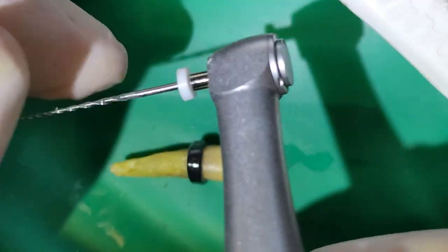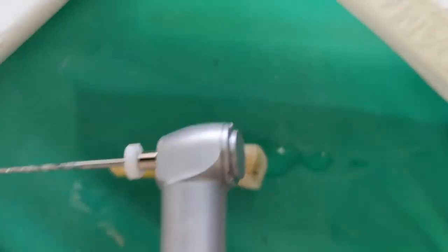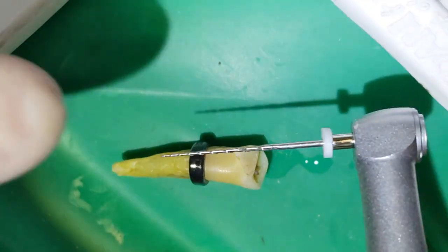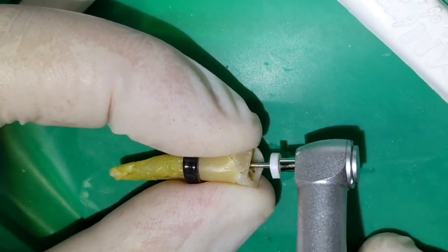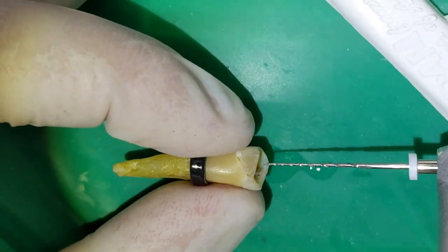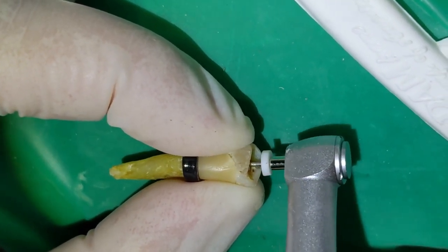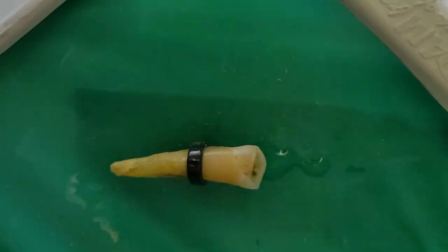And what I like to do with these after I use them as a back and forth reciprocating motion, I switch it back to rotating, and the rotational helps, it's like a corkscrew. It helps pull out any debris from inside. So I like to use that to kind of clean up afterwards. Great.